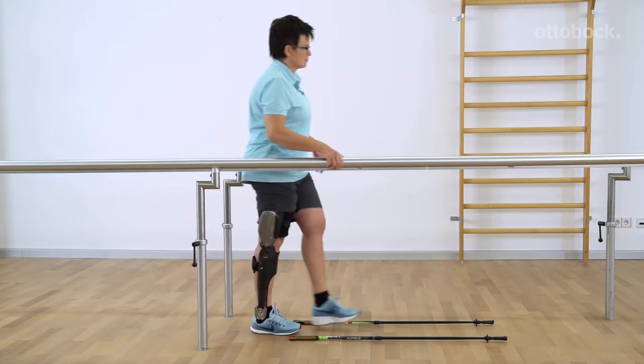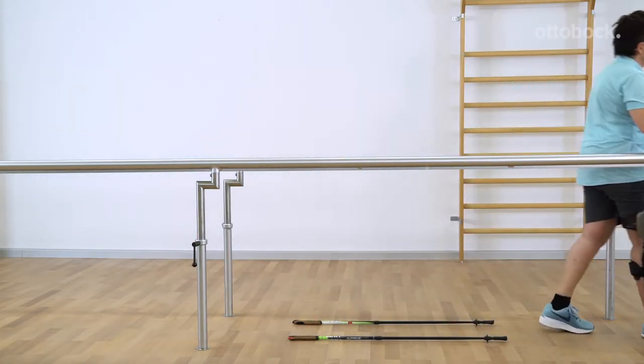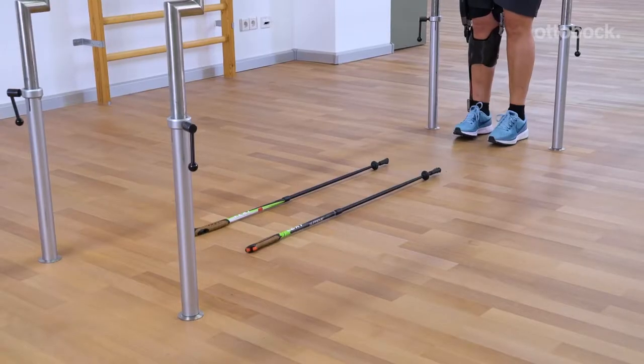An appropriate gate width results in a good rollover motion of the foot and is important for releasing the stance phase reliably.